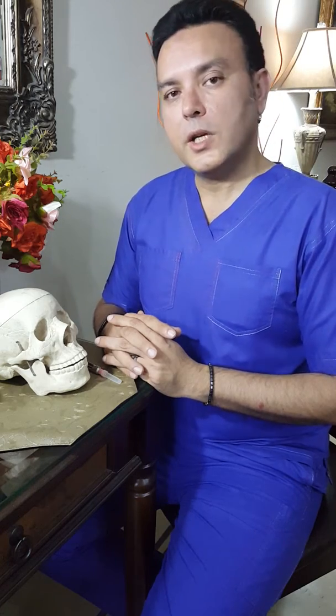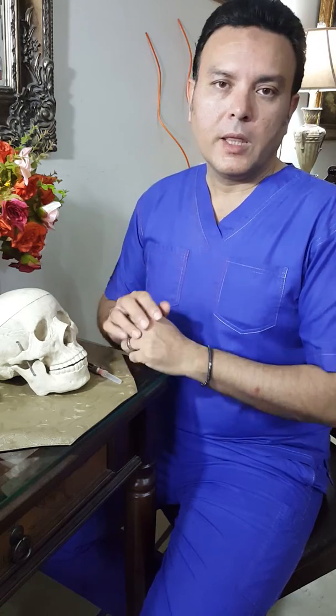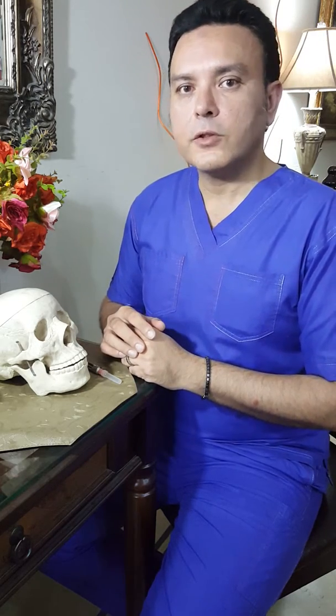Welcome back to California Care. Today we are going to talk about a pediatric injection technique that saves a lot of agony and trouble both for the patient and for the operator.